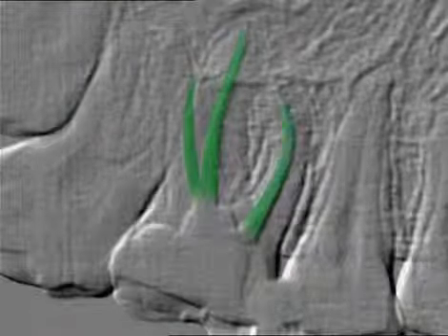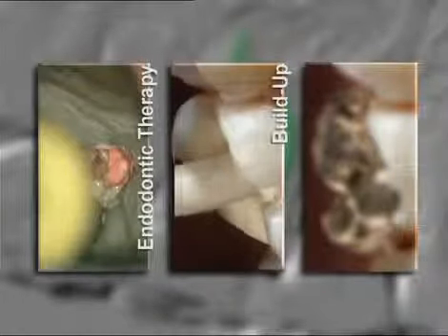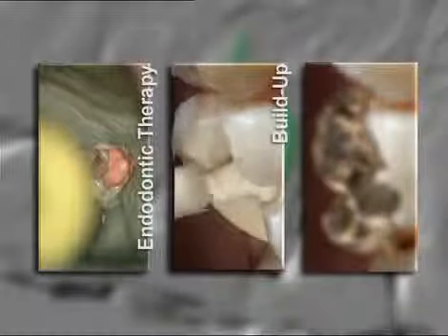The synoptic treatment plan should give a precise idea of all necessary procedures, as well as a prognosis of the treatment to the patient. In this case, it consists of the non-surgical root canal therapy of the upper left first molar, the buildup of the tooth with bonded composite, as well as a final restoration with a partial crown.